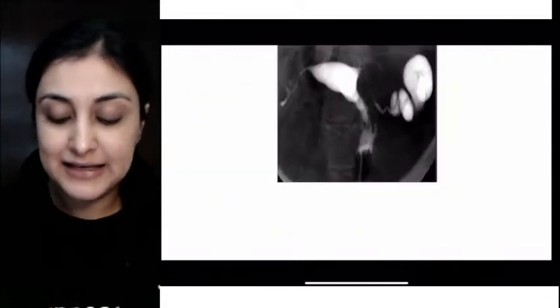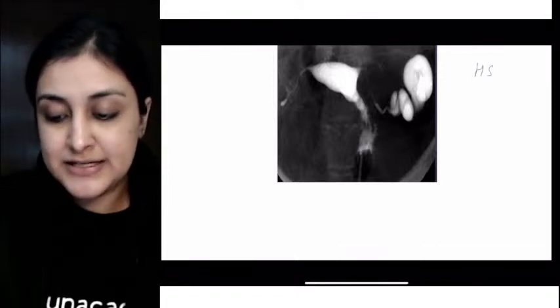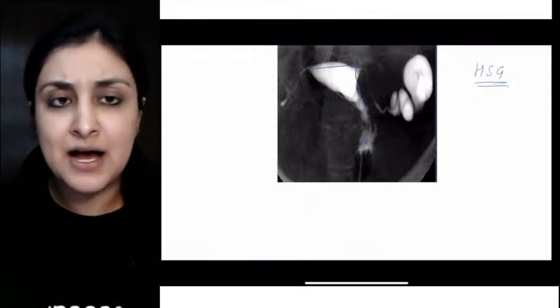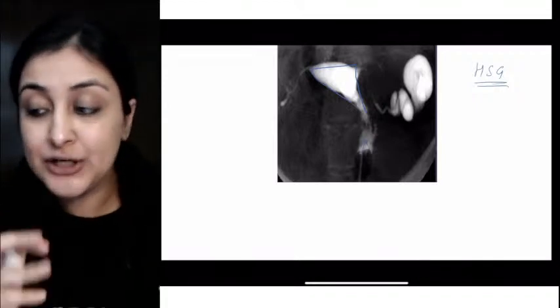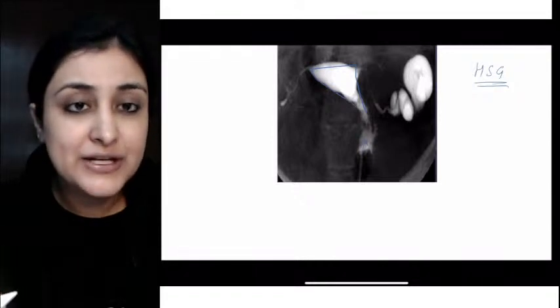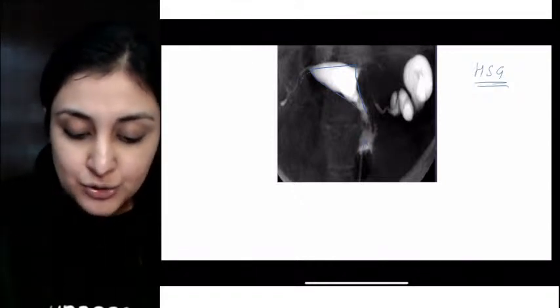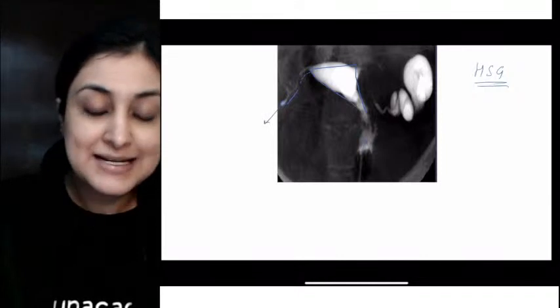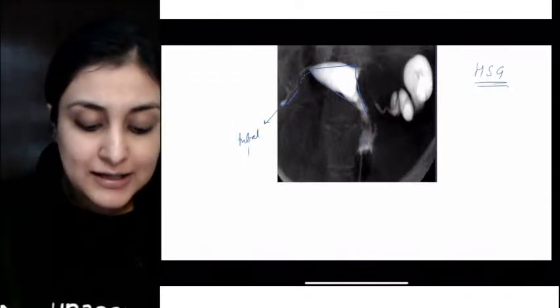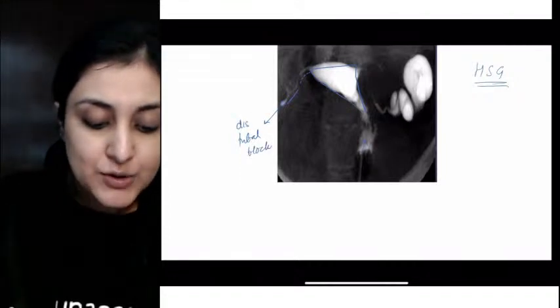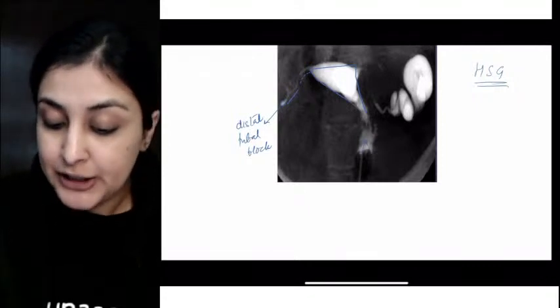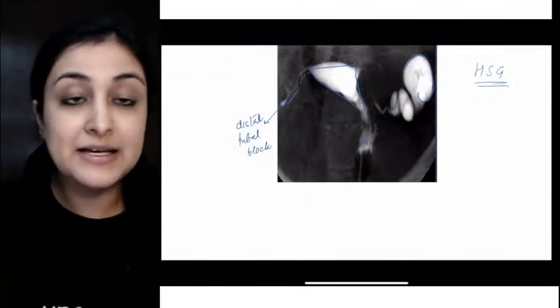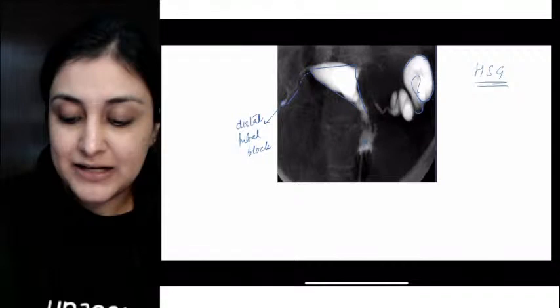What about this case? What are we seeing here? Again in HSG, everybody agrees this is a hysterosalpingography. Now is there a problem with uterus? No. Uterus appears how it should, triangular. What is happening with tubes? Is there free spill that we are seeing? This is the right tube and I see that the tube stopped here. The thin tube stopped here. So is there free spill? No. What does this tell us? That there is a block. There is a tubal block that you are seeing distally, distal tubal block. On the other hand, left side, what is happening? Tube has become very distended. Again it is not showing any spill. Contrast is not coming into the peritoneum. It has become very loculated and very dilated. What appearance is this called? This is called a tobacco pouch appearance. Tobacco pouch or retort shaped fallopian tube. This is because the tube is distended, called hydrosalpinx.